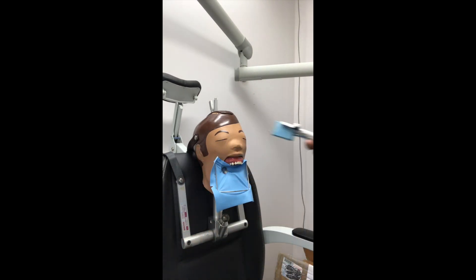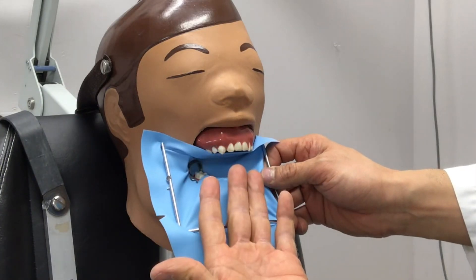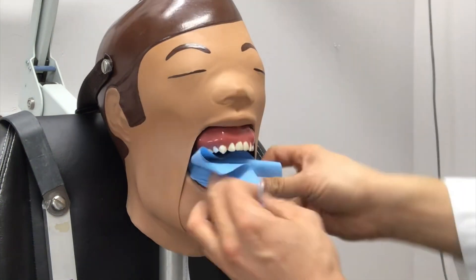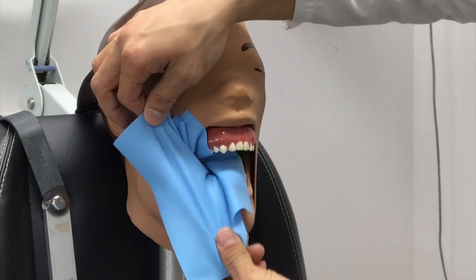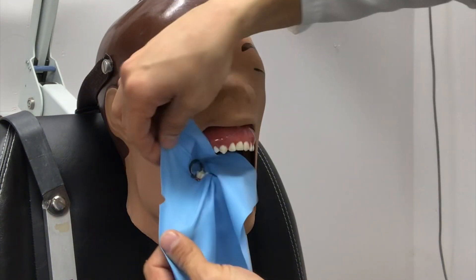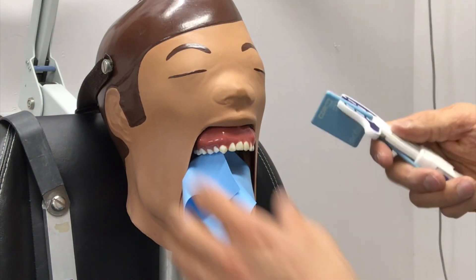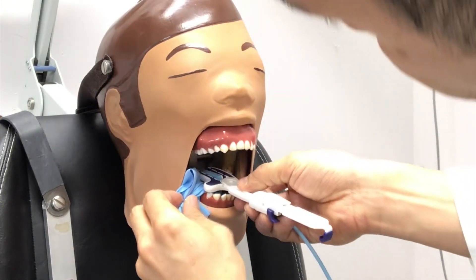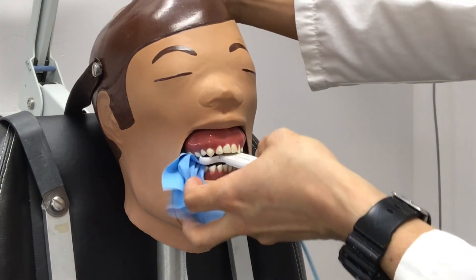What I do is take the rubber dam — you can use this with the rubber dam frame on or off, it's faster for me to take it off. I tear a little notch so when things get messy with saliva, I'm not wasting time figuring out where my rubber dam goes. I know this little groove always goes to my right — and you can do this with a rubber dam punch too before you start. We pull this off to the side, slide this in, get Dexter to open really big, and slide this in. You can see how that little groove helps me when I bring my tube head up.